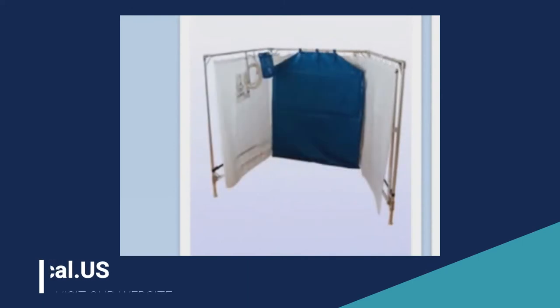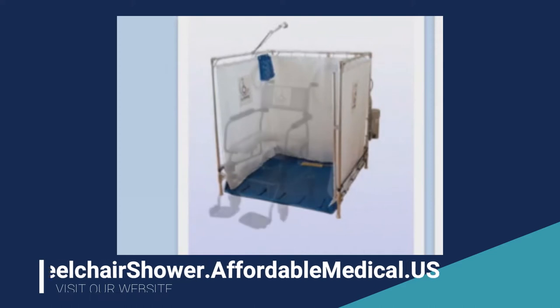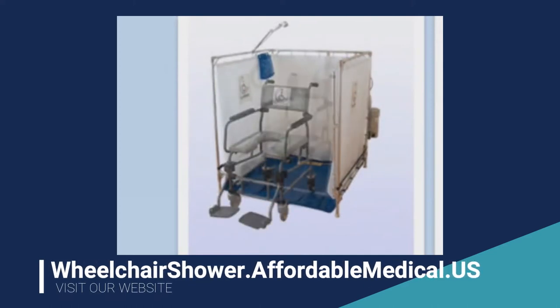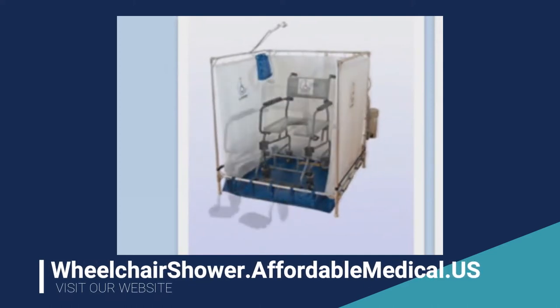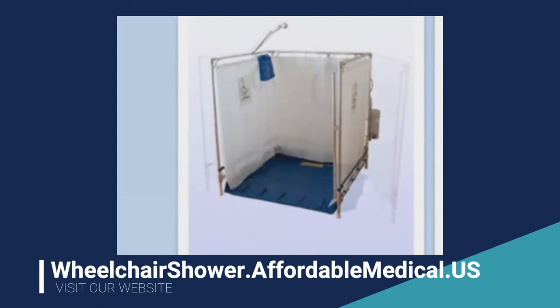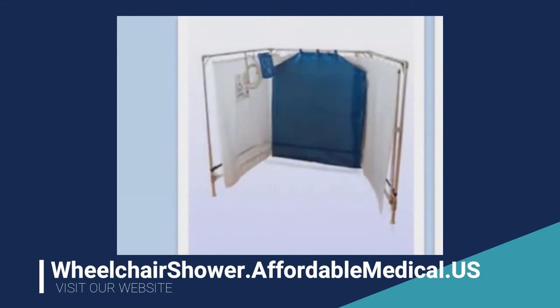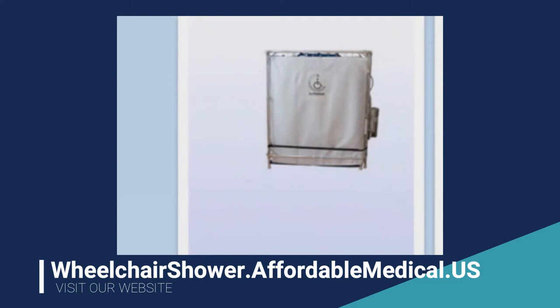Once the shower is done and the person is out, come back and just take a small wash rag and wipe the curtains down a little bit. Get most of the moisture off. Although the curtains are germicide-embedded, which is mildew resistant and helps considerably to keep any mildew issues from happening, it's always a good idea to dry it as completely as you can with just a light towel.